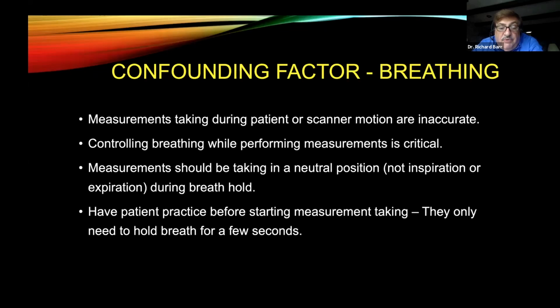So we usually practice with the patient before we start taking measurements, because usually when we say stop breathing, they take in a deep breath and do a Valsalva. So we make sure before we start doing our measurements that we practice with the patient so they understand that when we say stop breathing, they just stop breathing.